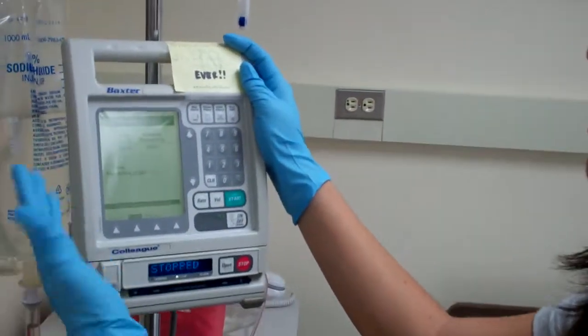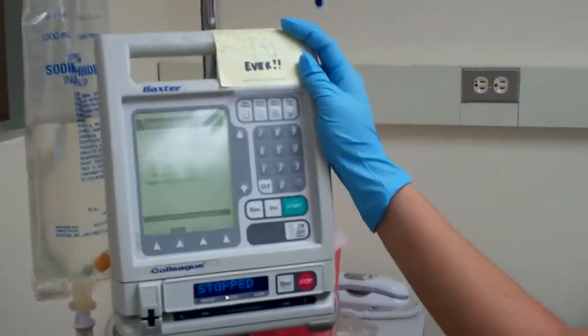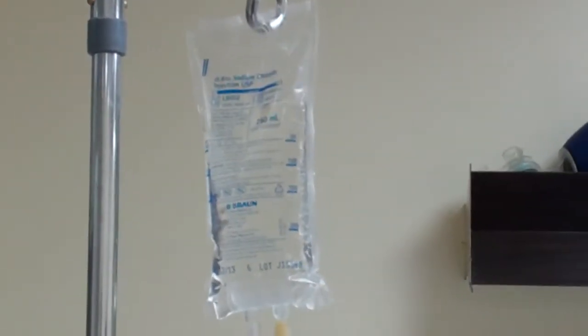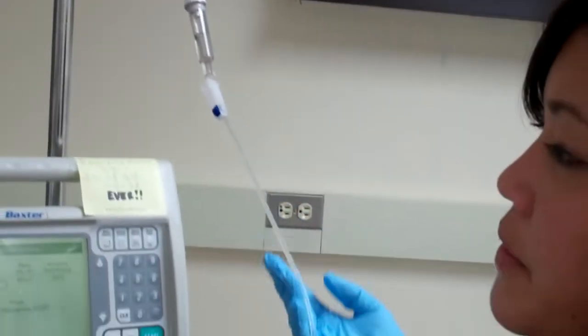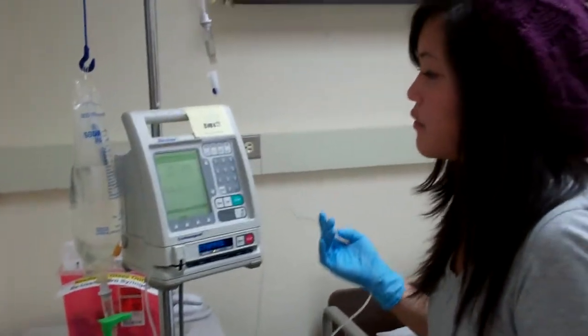So, I don't know, like 60 milliliters or 50 milliliters over an hour. Then I would also look at my volume to be infused in the bag, making sure that I include the flush for this. For an IV piggyback, I would include a 20 mL flush. If I was antegrading, it would be different.